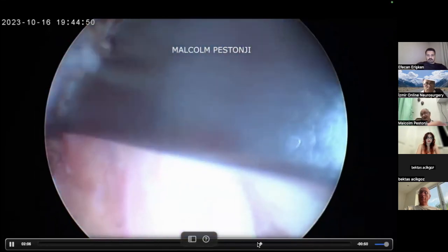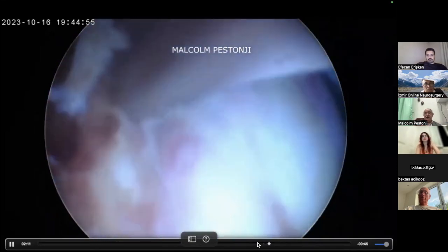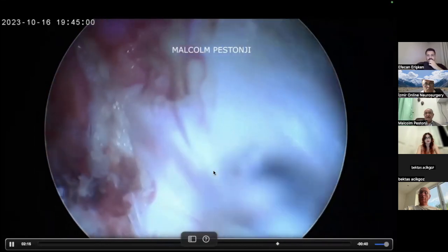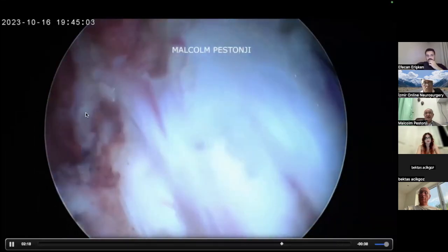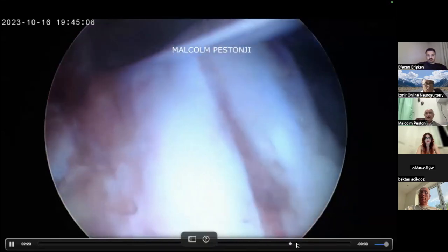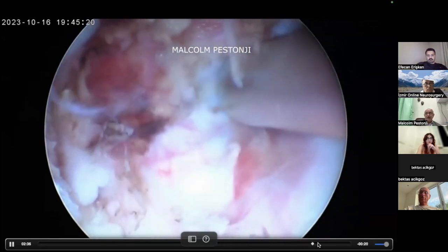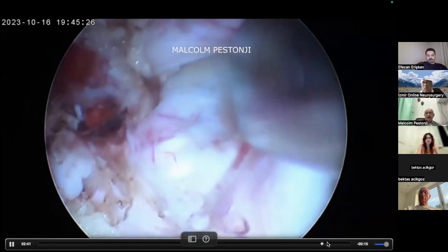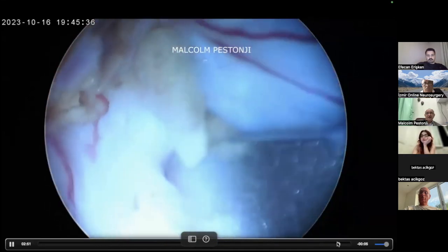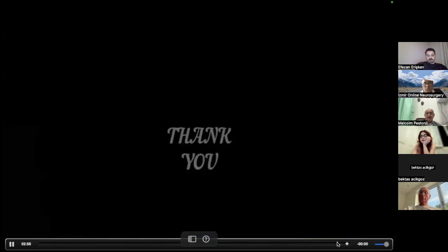Now I'm going lateral to the root. I'm mobilizing the root inwards slowly. And I'm trying to separate out this tissue. Can you see this? See its vascularity. See how this PLL tissue over here is stuck to the root. Slowly separating it out, mobilizing the root. Again, burning, cleaning, cutting, all the usual muck work has to be done. You can see the discal surface below. And you can see how the plasma relieves the root. And eventually, nothing below the root, everything neat and clean.